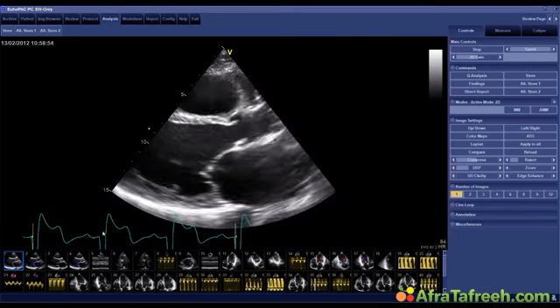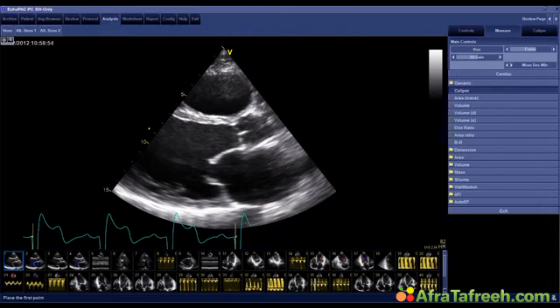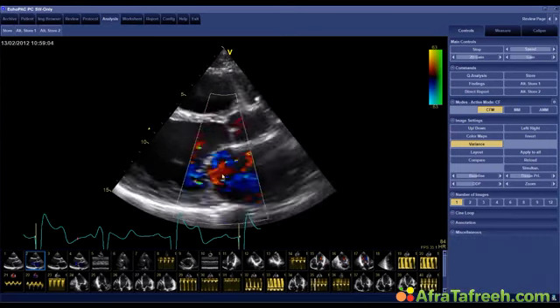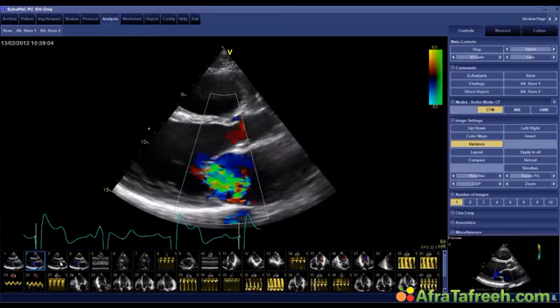Okay, so you can see that the patient has an enlarged left ventricle. You can measure the diameter of the left ventricle here. 63. Remember, everything that is above maybe 52, 53 millimeters is suspicious of dilatation. He was a fairly small young man, so this is certainly dilated. We have mitral regurgitation. The aortic valve looks quite nice.